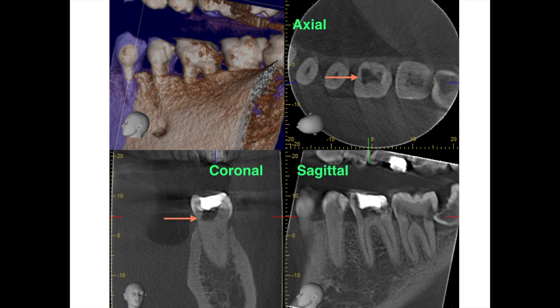The coronal view clearly shows the angulation — you can see how the access cavity is prepared; it's more mesially tilted. So angulation of the burr is very important when going in this time. Looking at the sagittal view, there is calcification very evident and very clear. This tooth probably had pulp calcification — it looks like a fixed pulp stone rather than a removable one. All we need to do is get into that calcified area and negotiate to find the patent canal.